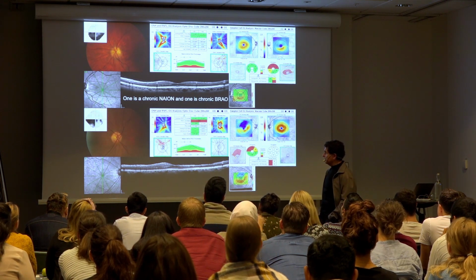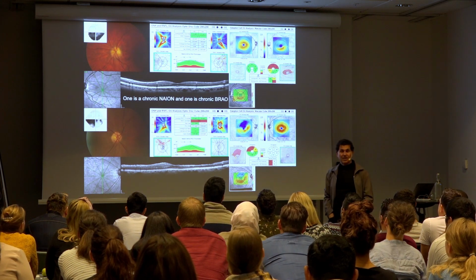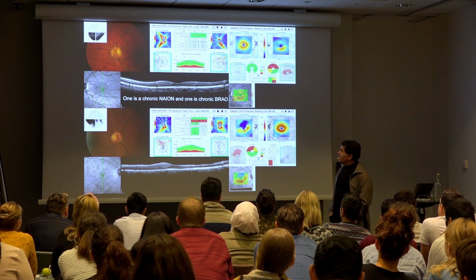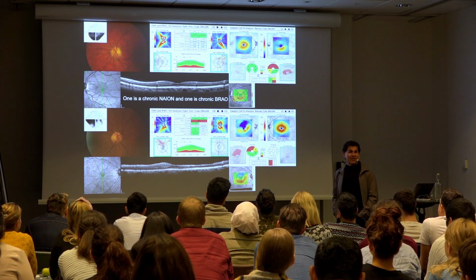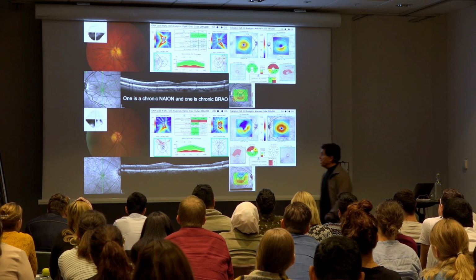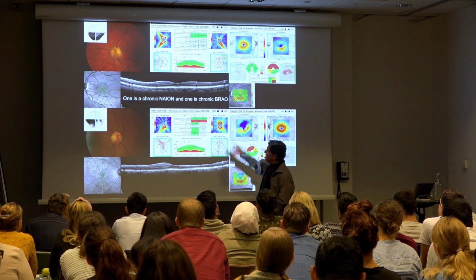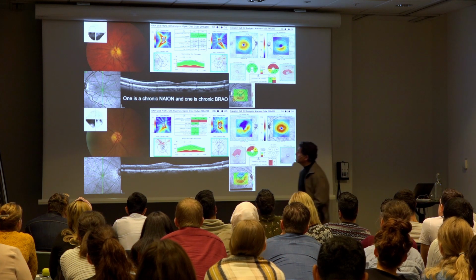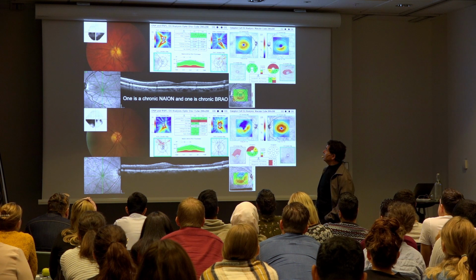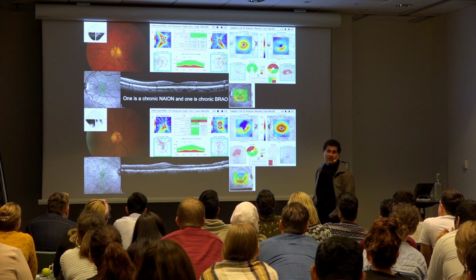More atrophy downwards. But which layers? That's the key. The nuclear layer. But what inner layer, what differentiates the two? Not just the amount of thickness, yes, but what's present in the upper one that's not present in the lower one? Ganglion. Well, the ganglion cell layer is thin in both of them. We already established that, right? As we've seen in the ganglion cell plot. But what other layer is affected?